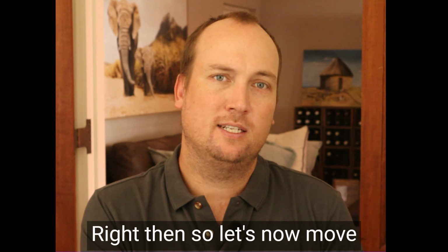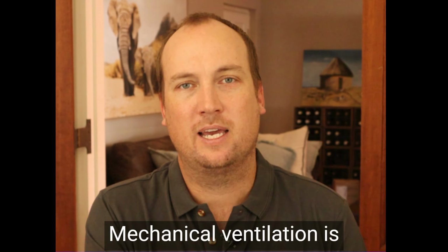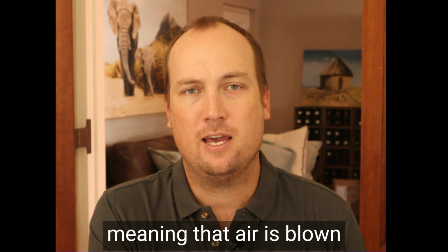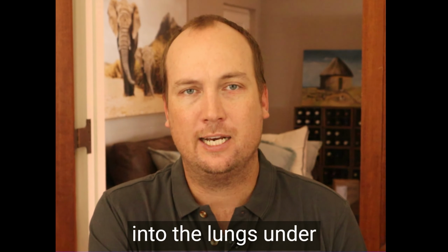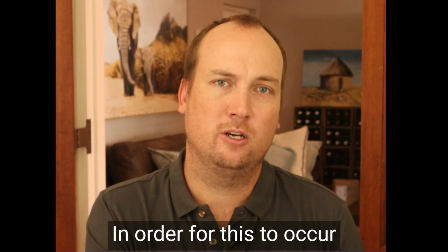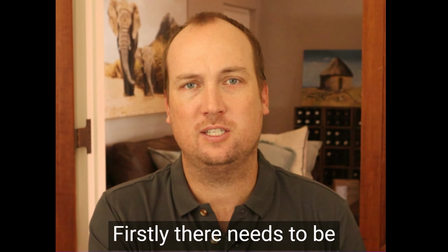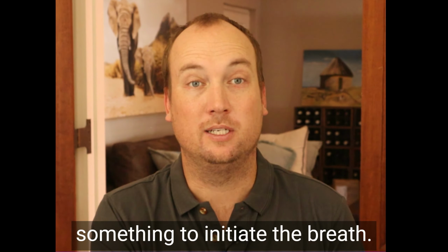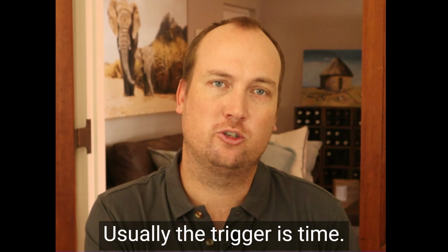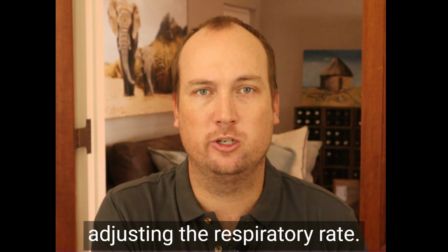Right then, so let's now move on to mechanical ventilation. Mechanical ventilation is positive pressure ventilation, meaning that air is blown into the lungs under pressure by the ventilator. In order for this to occur, there need to be some control ventilator settings. Firstly, there needs to be something to initiate the breath. We call this the trigger. Usually the trigger is time. We can adjust this by adjusting the respiratory rate.